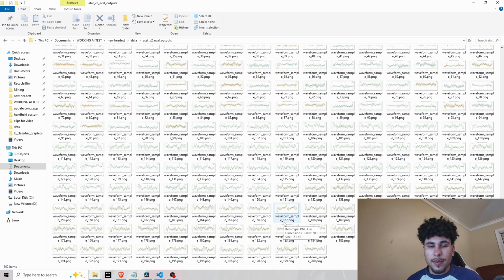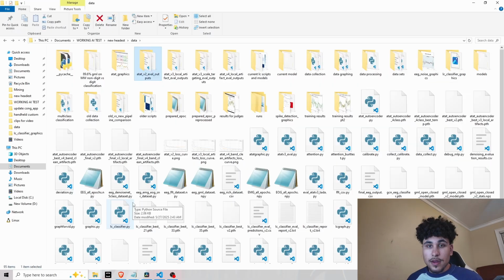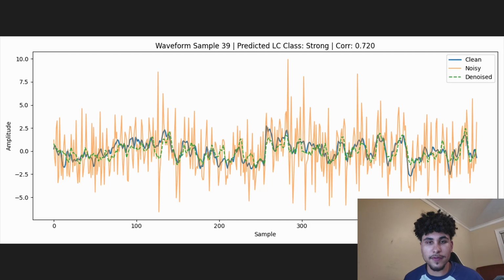And when I say test, I mean I really tested it. Each of these pictures are graphics I ran on the pipeline to see how it performed at denoising in different scenarios. Not just that, but each of these files and folders all relate to code, graphics, and other things generated as a part of this entire denoising project. Okay, so let's take a look at a few of the results.